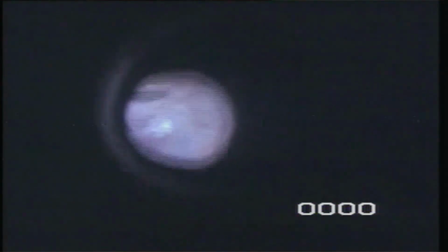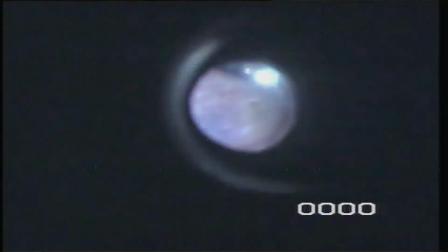And when we remove all this traction around the break, you can see that the break limply falls back on the retina. In our surgery, many times one will have to get used to managing under suboptimal visualization, because intraoperative blood is a constant menace. And when there's oozing, it's better to address that issue quickly, otherwise we may have an issue on hand where the whole thing becomes another surgery by itself, removing the epiretinal blood.